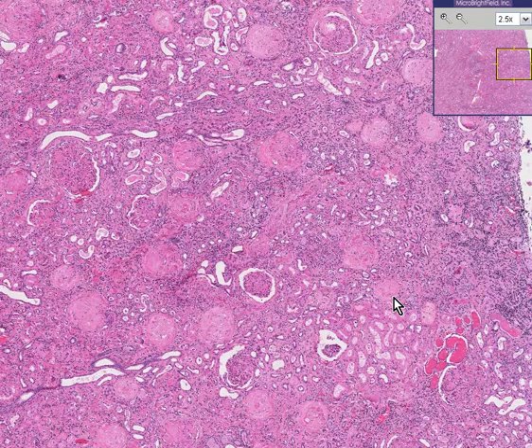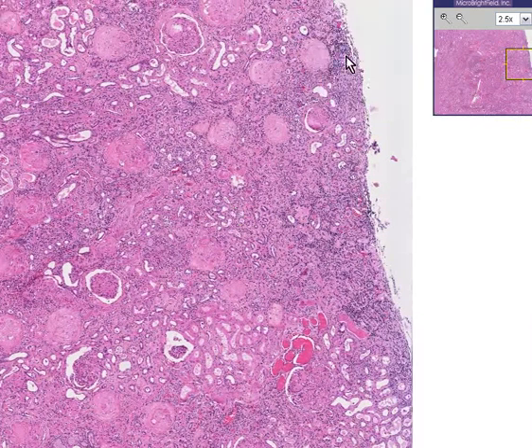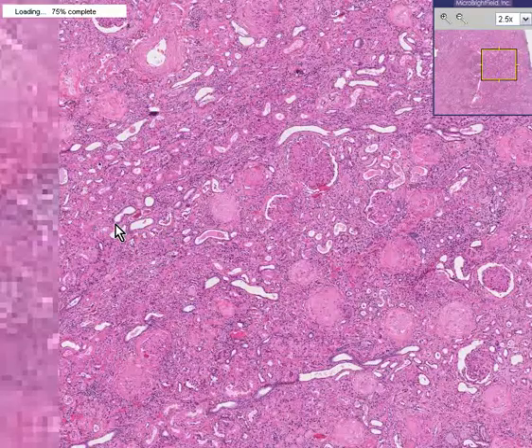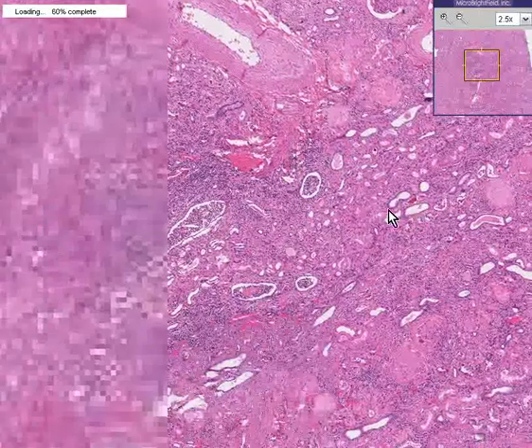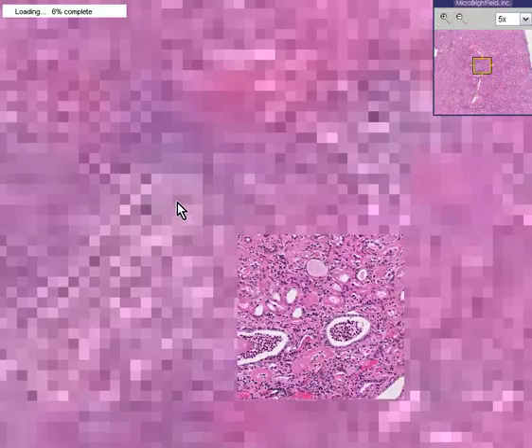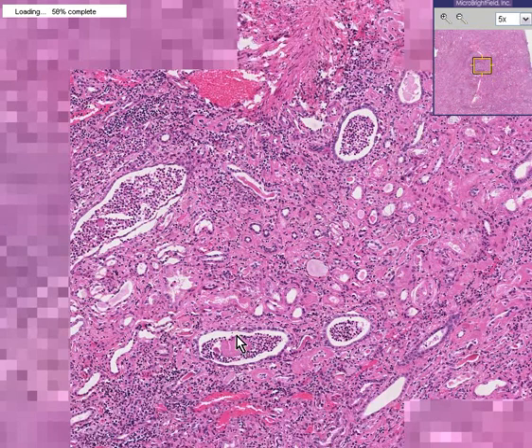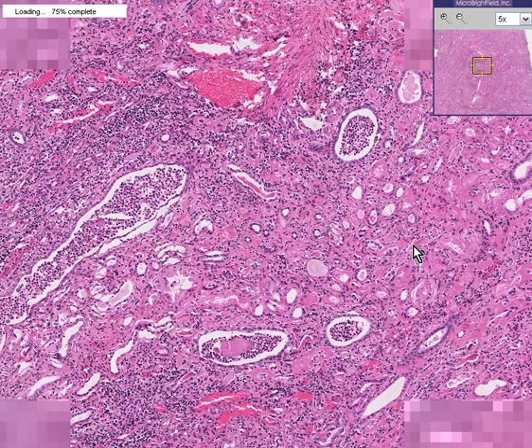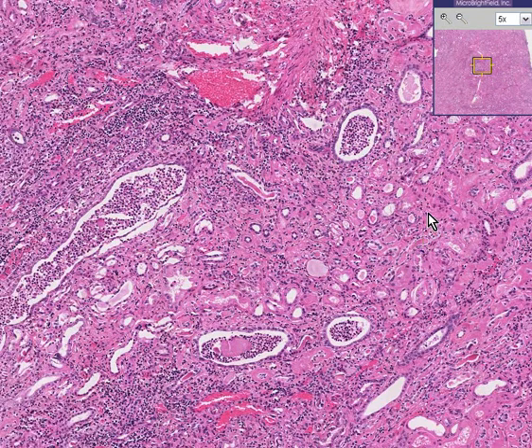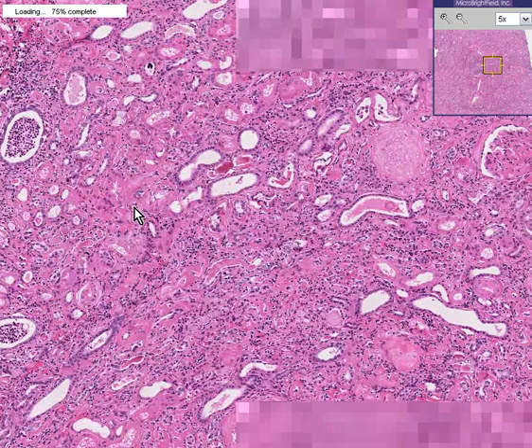Another name for this disease is Kimmelstiel-Wilson disease. Also notice that the cortex has little patches of chronic inflammatory cells, and some of the inflammatory cells fill up the degenerated tubules as well. This is a very classical appearance seen with many diabetics.